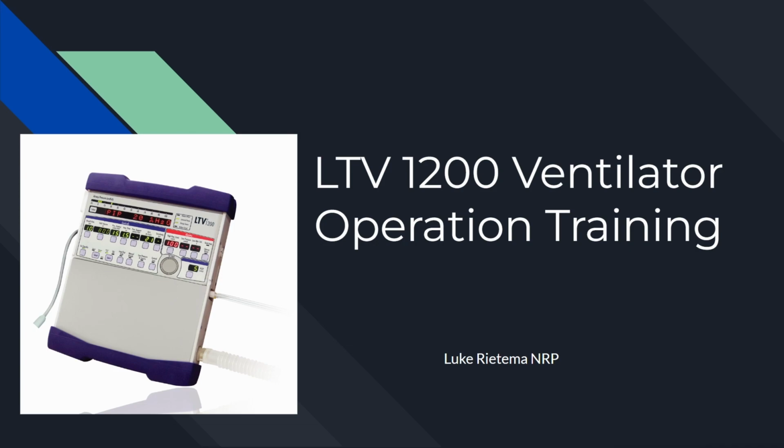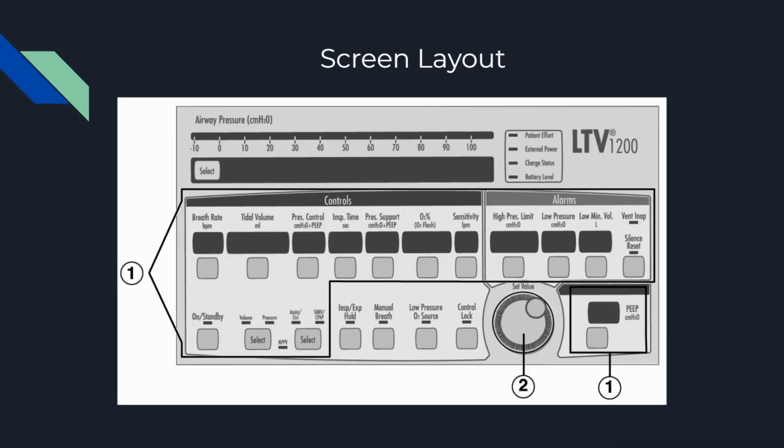This is the ventilator that we currently have in operation in our emergency department and on the floor. So let's jump into this. Alright guys, this video we're going to talk about how to actually operate this vent. So we're going to start with the screen layout.